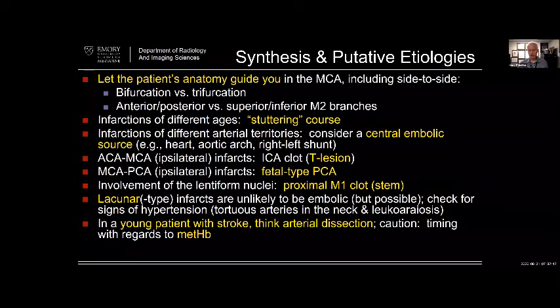And of course, with the MRI, it depends on whether it's intrinsically T1 hyperintense, aka T1 shortening, and where you can see it on the T1s.